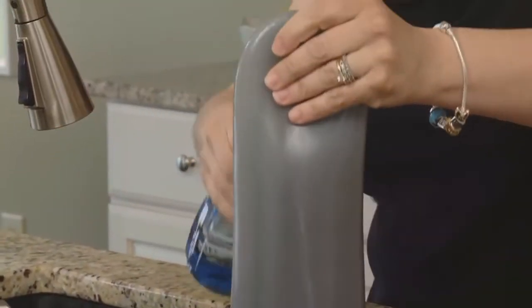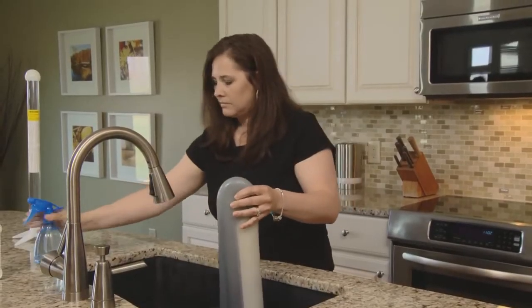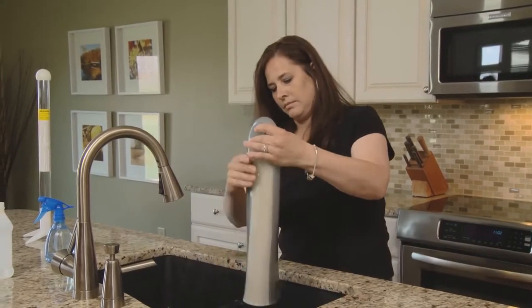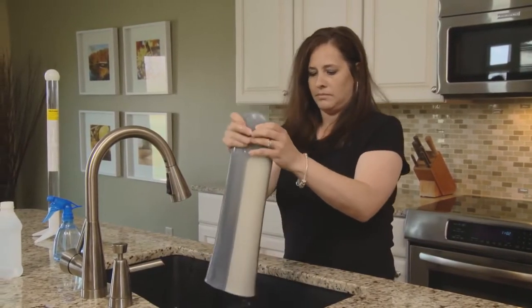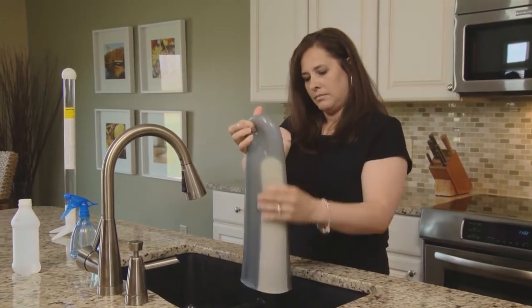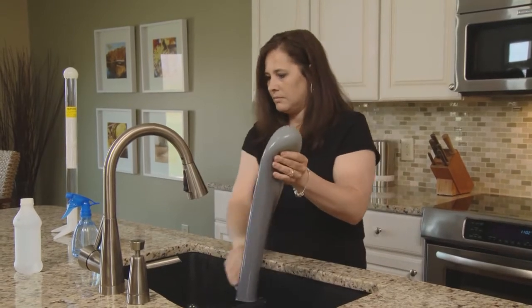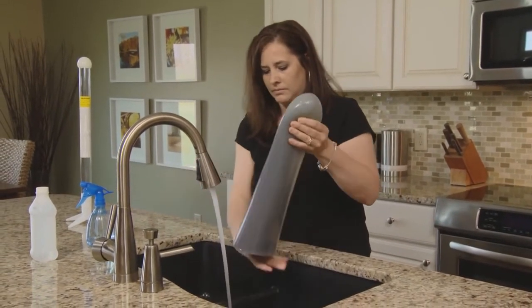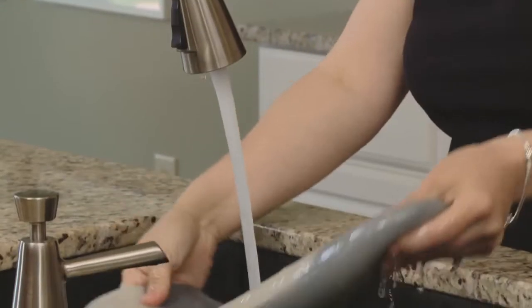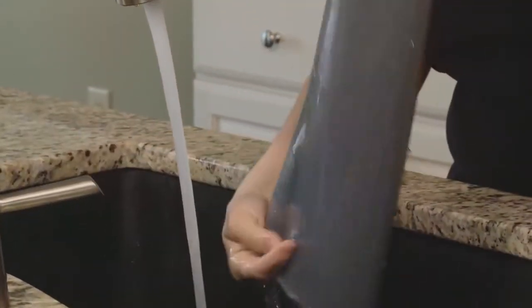disinfect each alpha liner by lightly wiping the gel side for 2 minutes with a small amount of ethyl or isopropyl alcohol. Do not use alcohol in large quantities or more frequently than once a week, or the gel may become firmer and less comfortable over time. Rinse off any excess alcohol with water, then proceed with the usual daily cleaning of the liner.